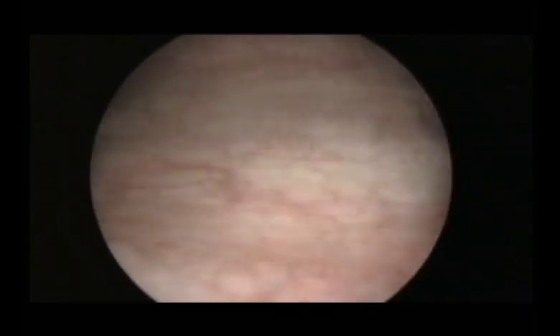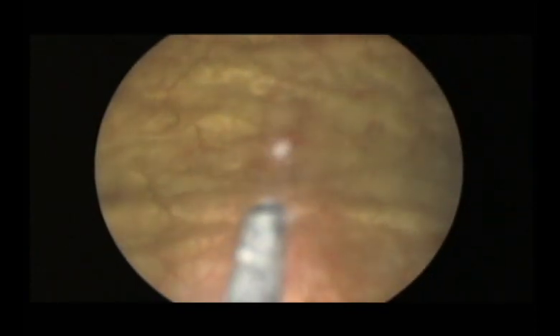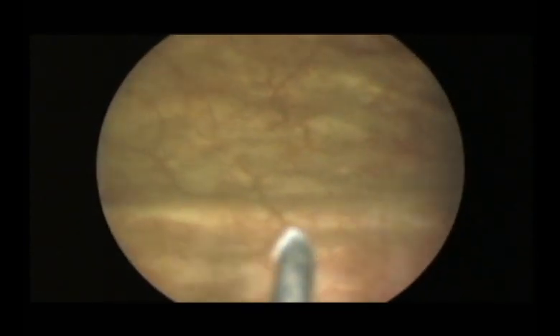We place the cystoscope between the two ureteric orifices and we advance the needle to be able to see the tip entirely. We then flush the needle with 2 ml of the solution containing the medication. With the medication we are using for this demonstration, a total of 20 injections with 1 ml will be evenly distributed into the detrusor wall and dome, spaced approximately 1 cm apart and 1 cm above the trigone. The injections will be done in 3 lines.